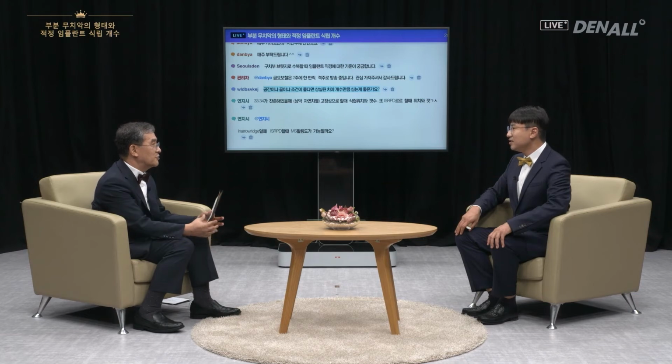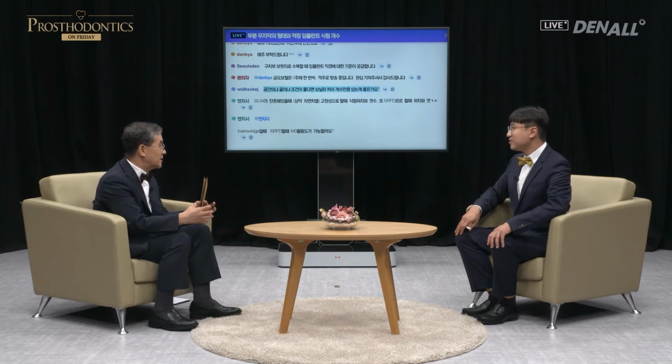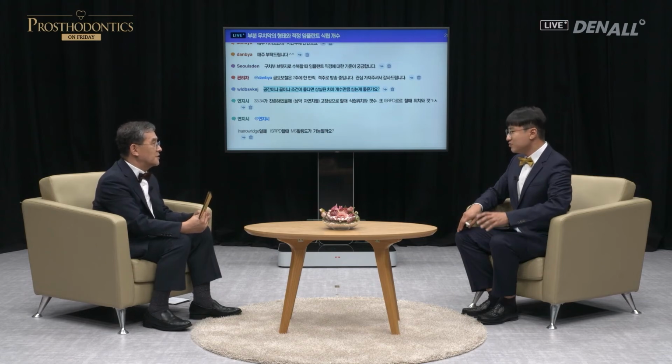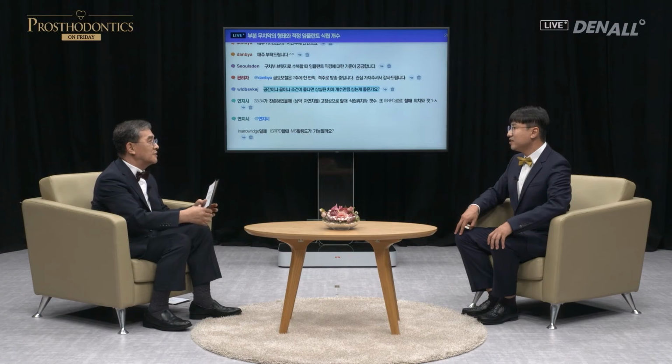I believe you should use smaller diameter than the conventional way because of biological reasons. Because I believe there's a higher possibility of biological problems compared with mechanical problems. And if you use non-hex implant, you can reduce the diameter.